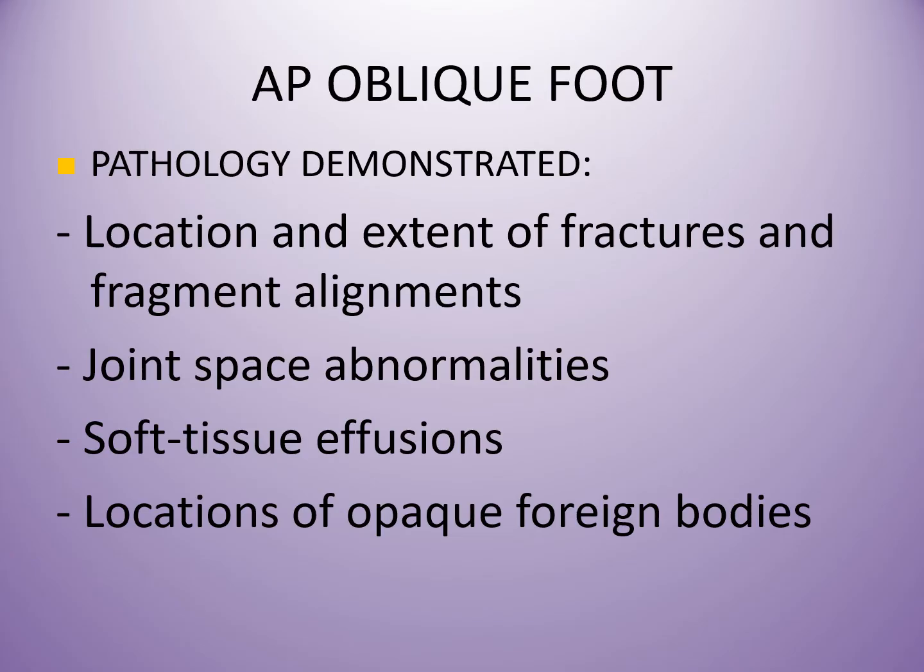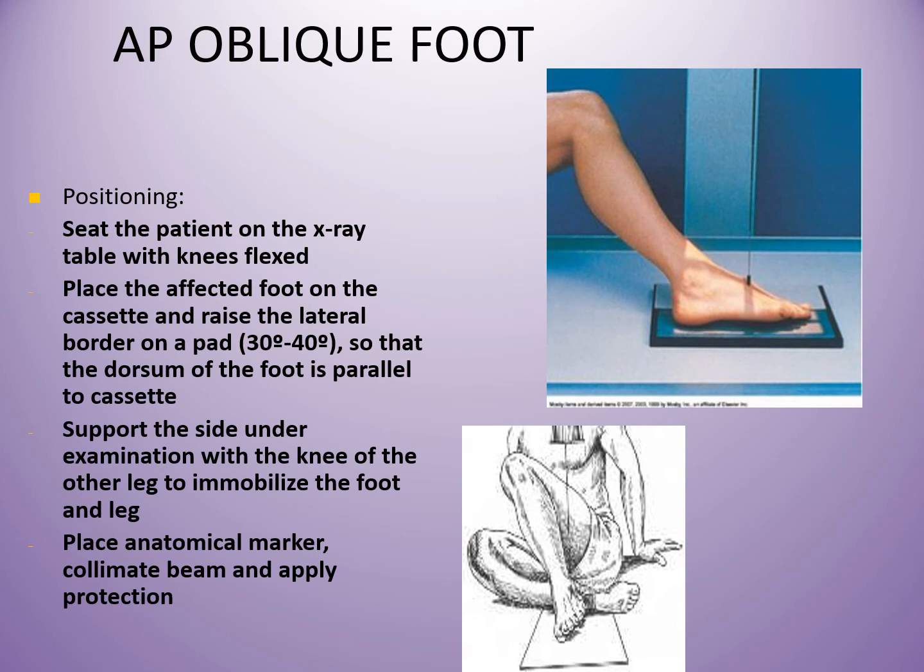Okay, oblique. Go for oblique foot. Alright, oblique foot. We also want to see the location of the fractures. AP and oblique are usually applied as the basic projection if the patient comes in. Then sit the patient, the patient can lie down, with the knee flexed a bit.